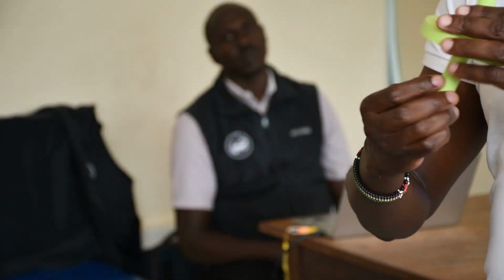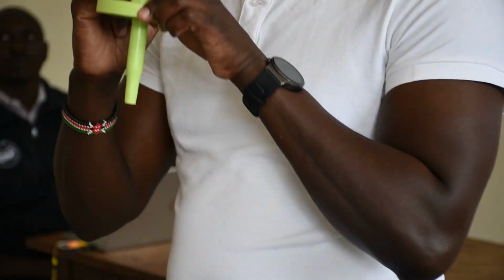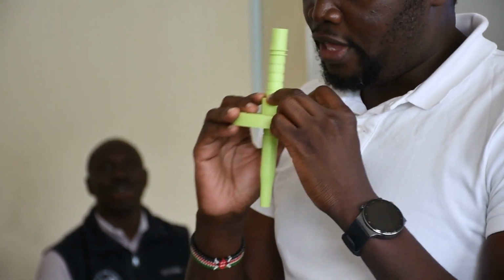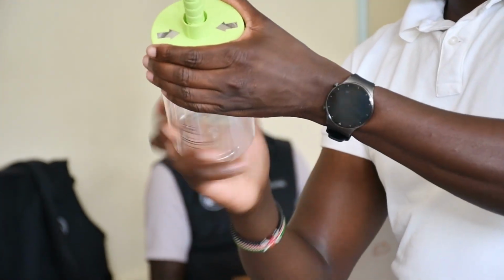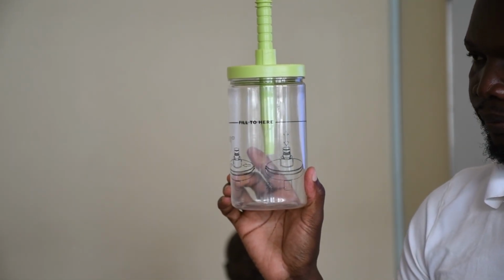Okay? How do we read the pressure? The number immediately above, the number visible, that is the pressure. Okay? So like right now, my number immediately above is 5. So that will be my pressure. Okay? So this is how this is. Any question on this? Okay?